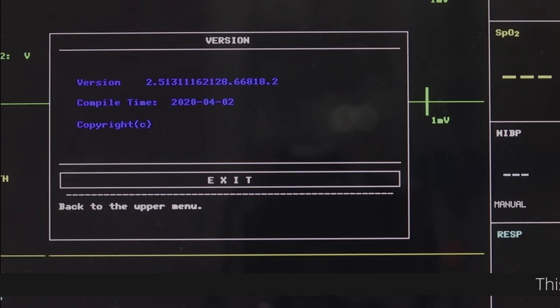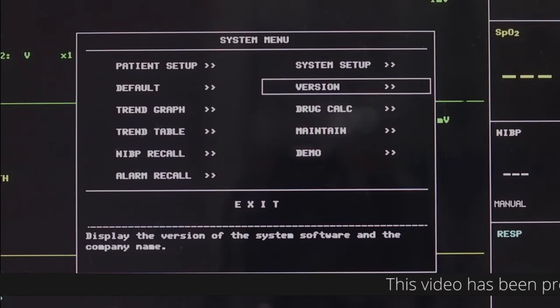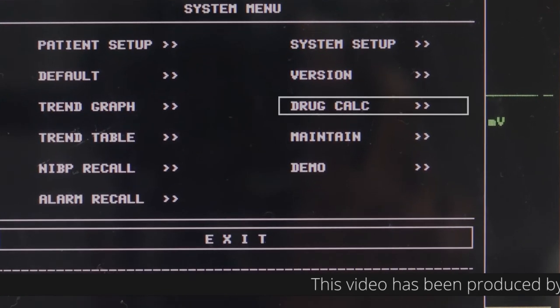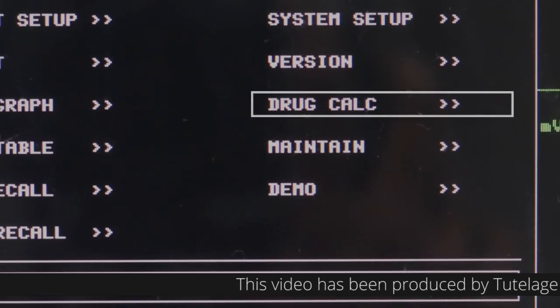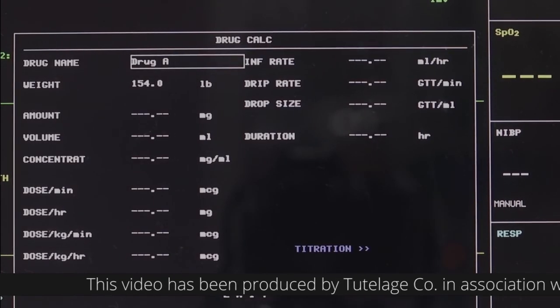Version tells you the software version of the monitor. Drug Calculation: You can use the Drug Calculation and Titration Table function of the monitor to calculate the concentration of 15 kinds of drugs.